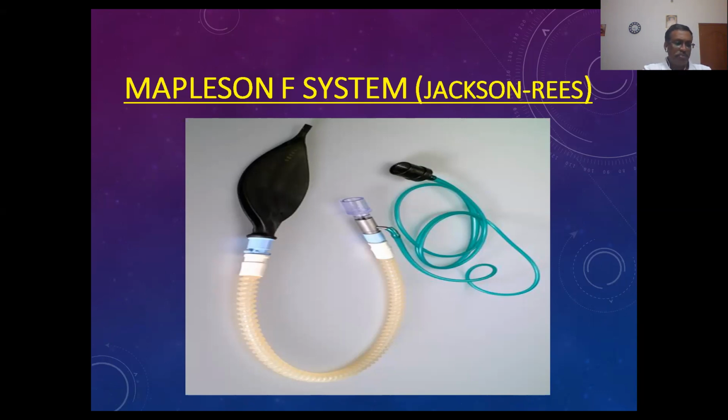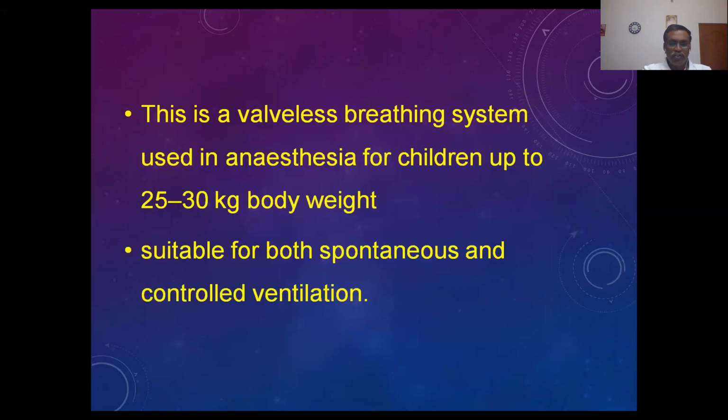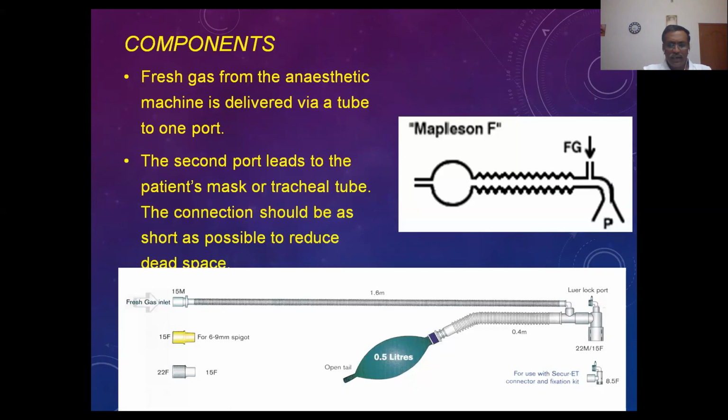And regarding this mechanism, I already told that it is suitable for both spontaneous and controlled ventilation. Okay. And these are all the components we already told earlier. By this reform, it has been adapted in a very good way.